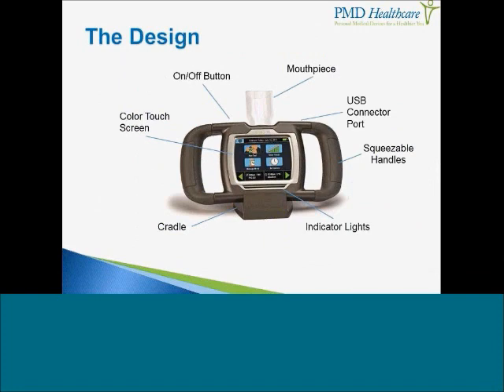This is what SpiroPD looks like. Starting at the top and moving across in a circle: you'll see the on-off button, your mouthpiece, the USB connector port where you'll plug your USB cable in to upload your data, the soft squeezable handles, the little blue indicator lights on the front of the device which will light up as you're expelling the air from your lungs, the cradle that you can store your device in, and then also the color touch screen.